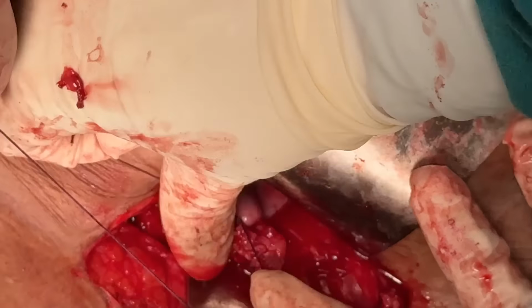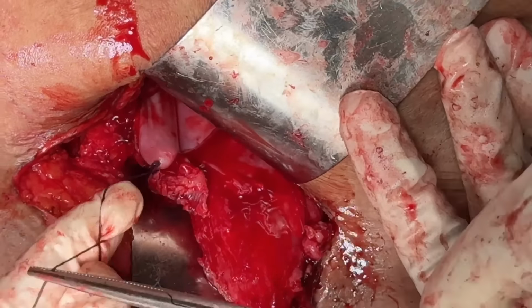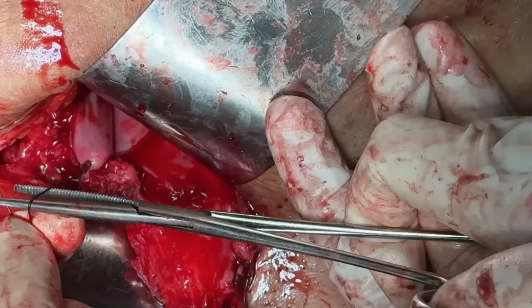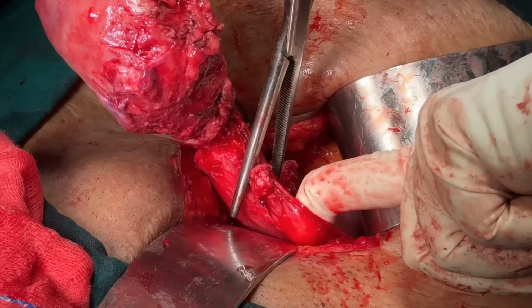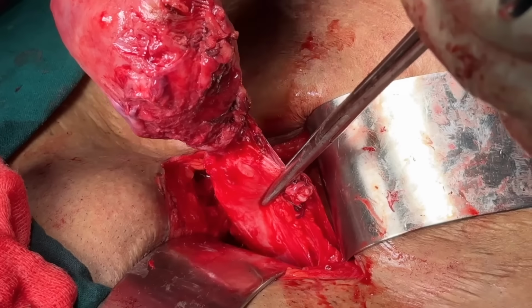Can you see again the nicely tied uterosacral ligament? When you do a hysterectomy, each and every ligament you should identify and do it properly. Now we keep one end of this uterosacral ligament long for apical suspension. After this, come to the other side and do exactly the same.